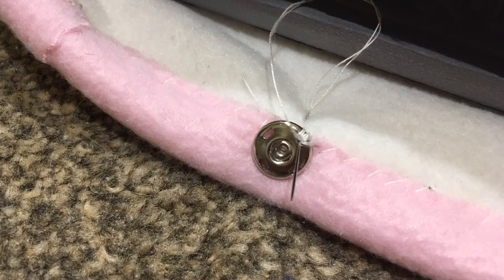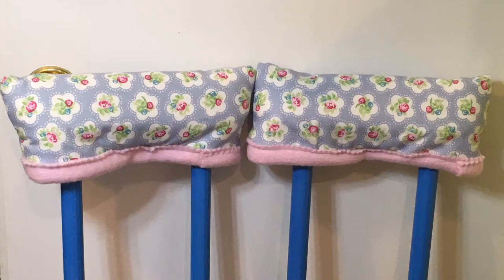And finally to finish the underarm covers I hand sewed on a pair of heavy duty metal poppers to hold the covers closed so they're not gaping.